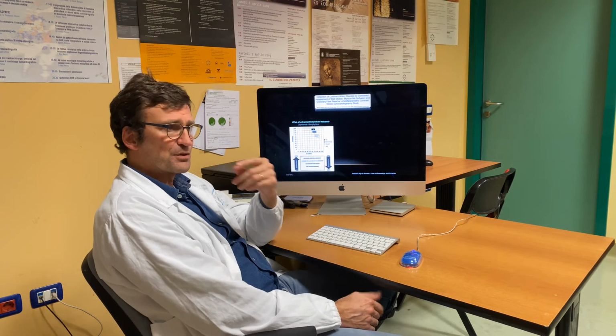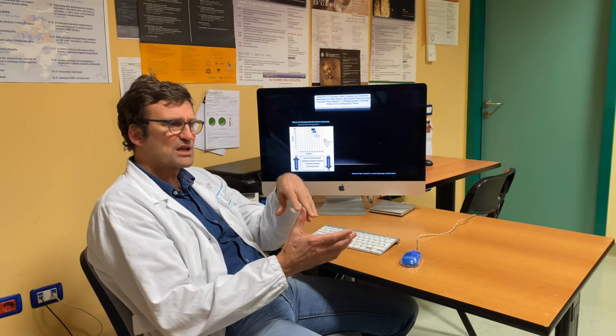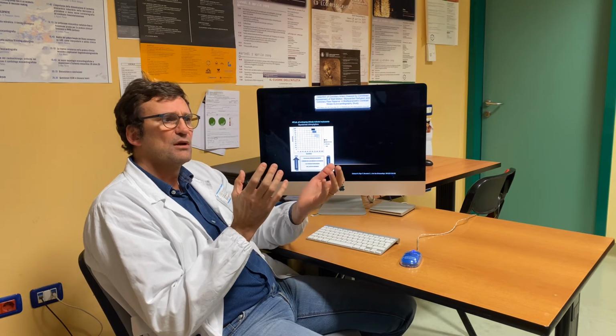So this is the concept of the multiparametric stress echo, that you have more variables to assess. It requires a little bit of thinking around this. So you should not consider too much perfusion in a 90-year-old, but you may do this when you see an athlete and you want to be very, very sensitive in your diagnosis, for example, myocardial bridges and so on.